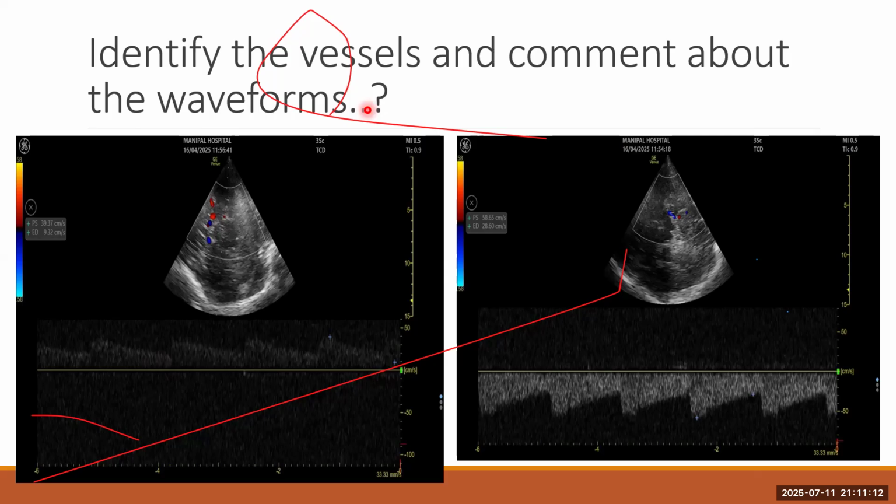What could be the possible reasons of P2 velocities being higher than P1 velocities? We have insonated P1, we have insonated P2. Aneurysmal dilatation. Aneurysmal dilatation, yeah. I mean, it should not raise the velocities. P1 has 39, whereas P2 has 58.